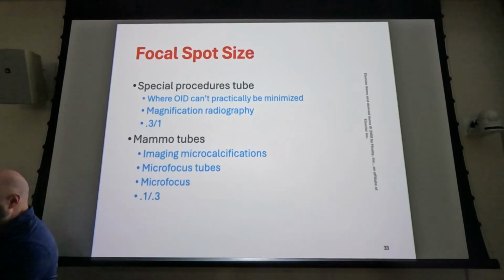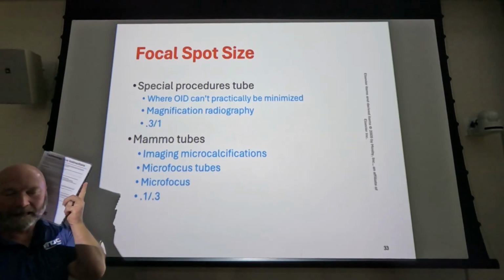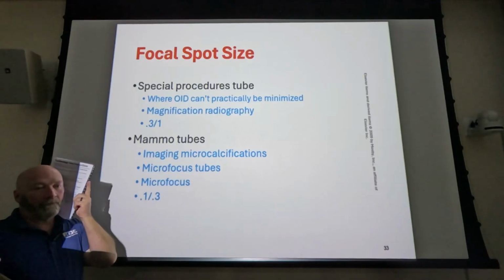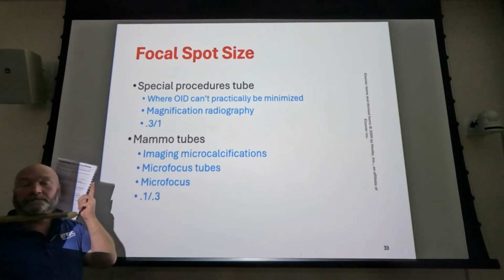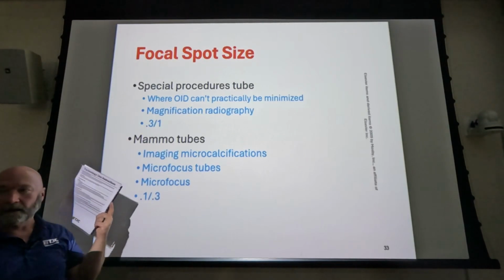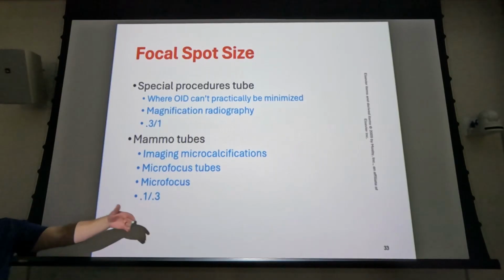Say I take an x-ray at 40 inches. SID doesn't really matter at this point. Say I put my image receptor right up against the patient's neck right here. And we've got wide angle radiation created in the neck. Is it going to hit the image receptor? Yeah? If I put it out here, will it hit the image receptor? No. So with the air gap technique, some of the scatter radiation that scatters off at a wide angle will miss the image receptor.